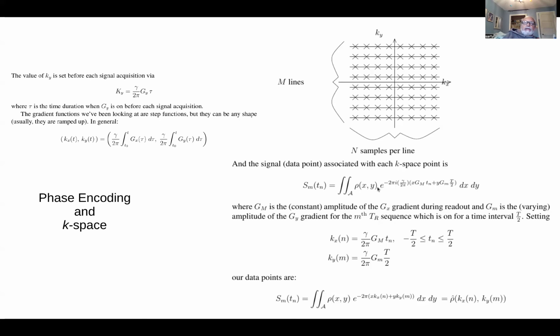So if we collect all this data, we apply a Fourier transform, say through a fast Fourier transform, FFT, whatever you take out of the canned packages that might come with Python or PulseSeq, I don't know what's in it. You apply that Fourier transform, and you end up with this image or an approximation of that image.